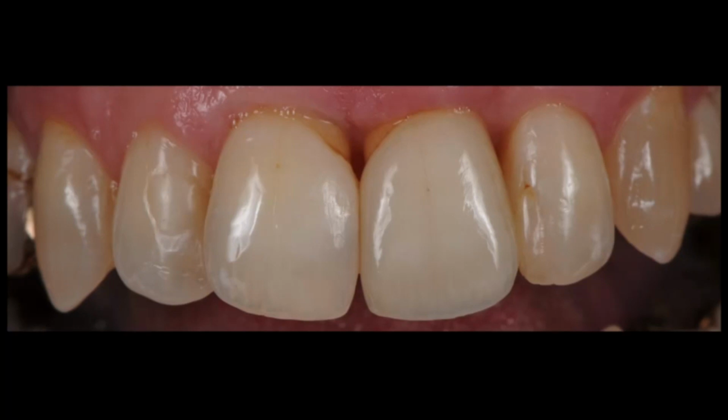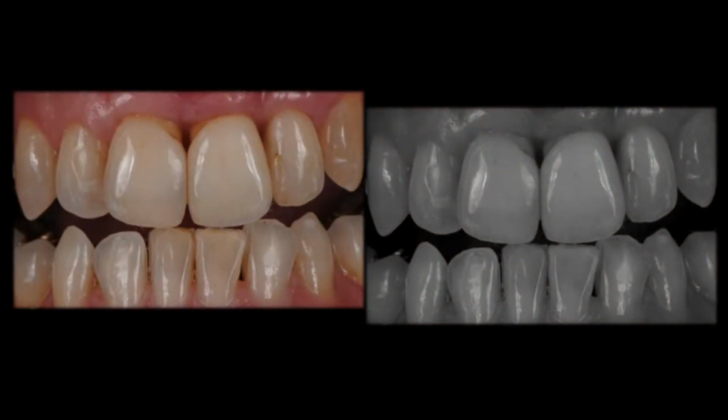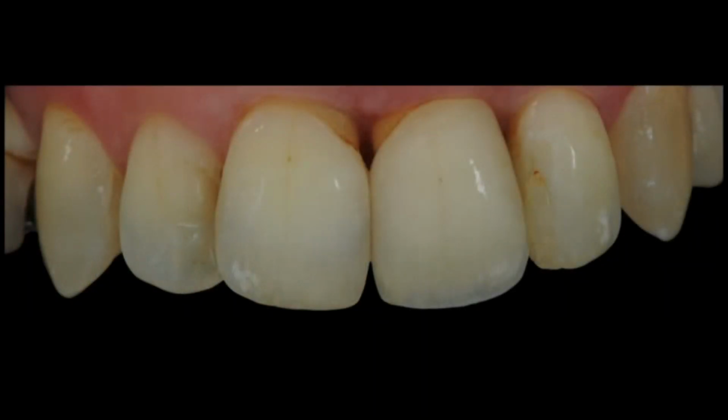We just placed the implant, we placed the crown, we polished everything, and then a few weeks later, she came back, and then we got the final shots. Even the black and white picture, even here you can't see that it is a faked version. It looks like a natural tooth. And even this picture where you got the chance to combine the natural tooth with the porcelain one, with the cross-polarizing filter, there's not really pretty much a distance.